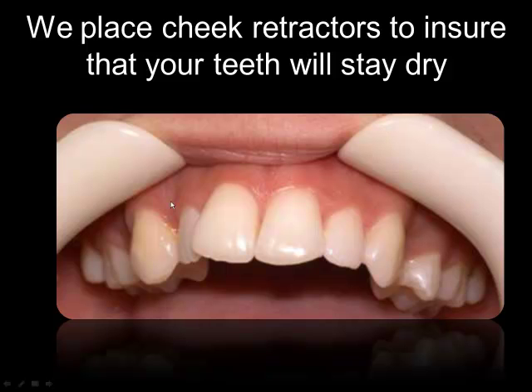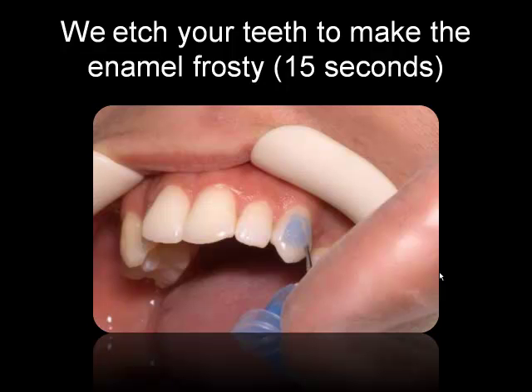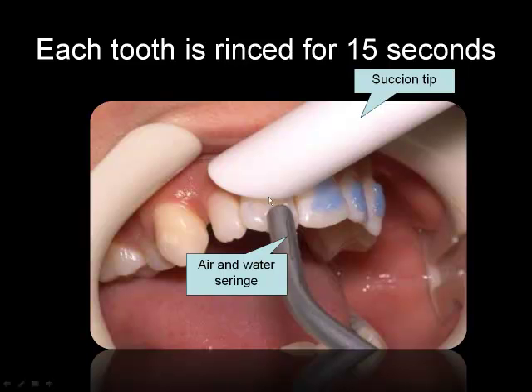So how do we do that? We place the cheek retractors right here in order for the teeth that will receive the brackets to be as dry as possible. Then we put a little primer — you can see the little blue thing right here where the bracket will be. It's a primer to let the bonding agent adhere to your tooth as best as possible. We keep this for about 15 seconds, doing a few teeth at a time.